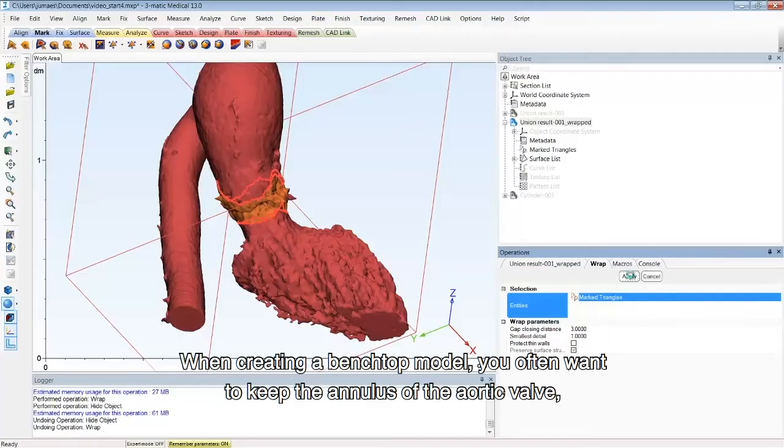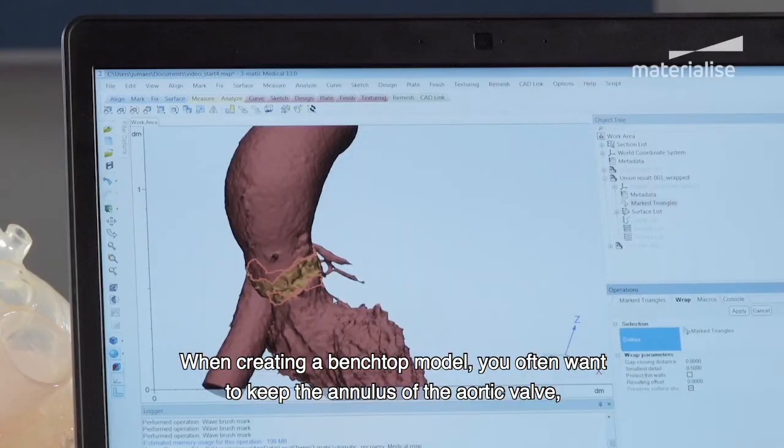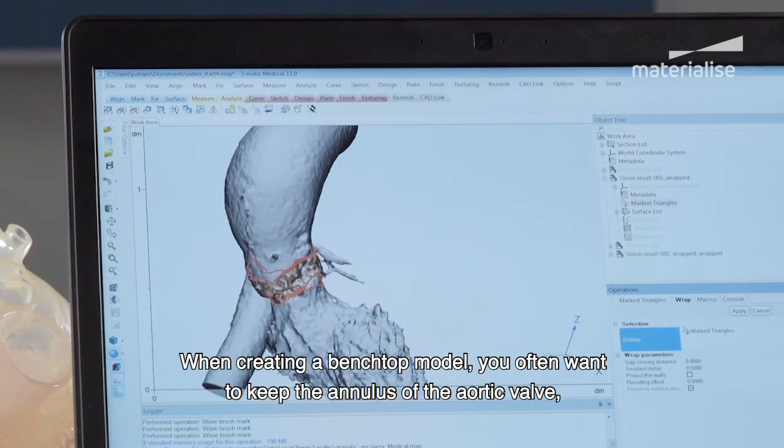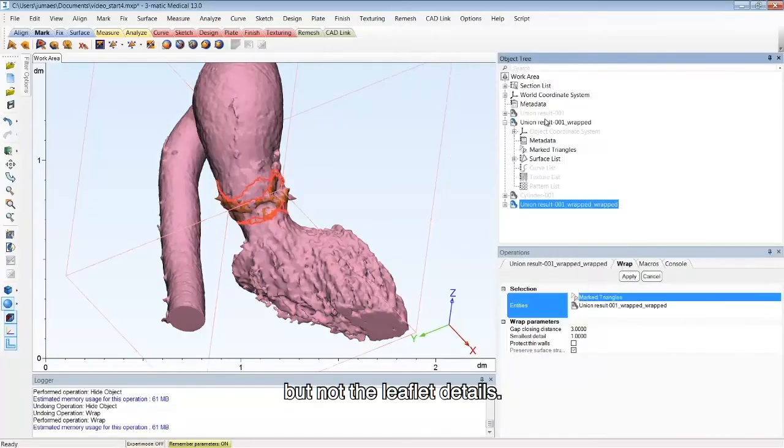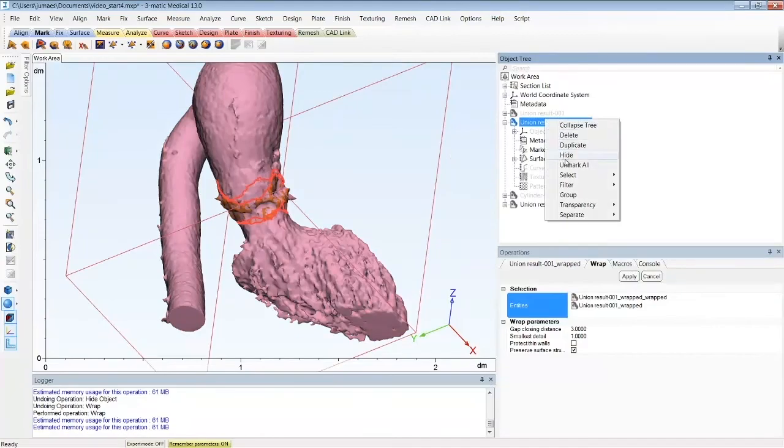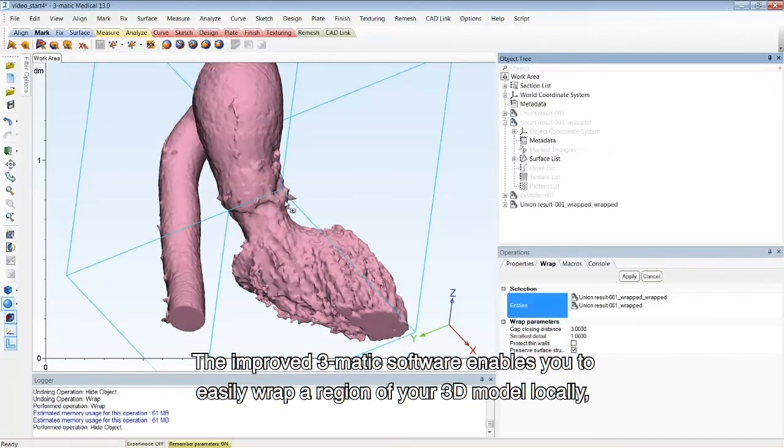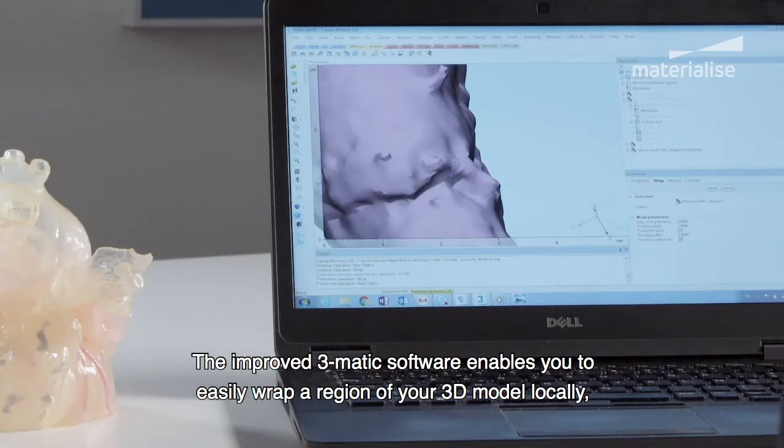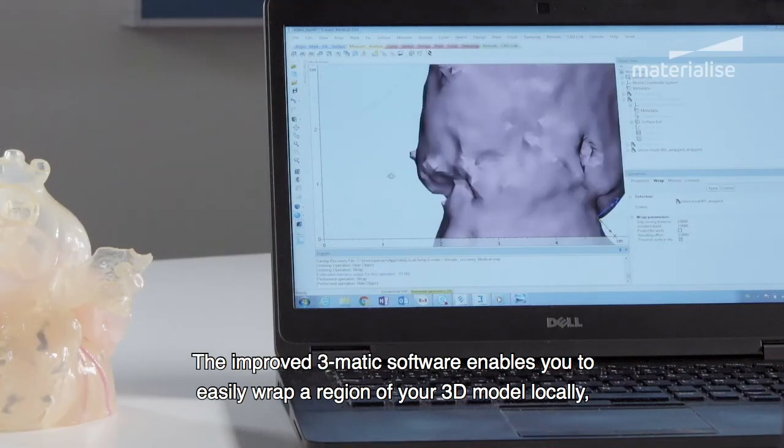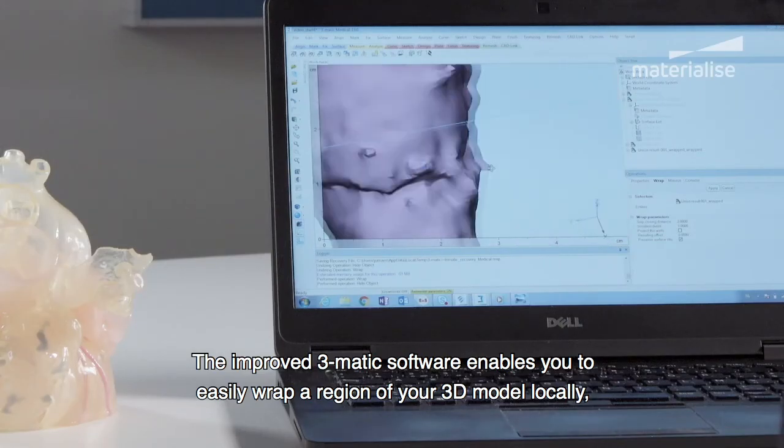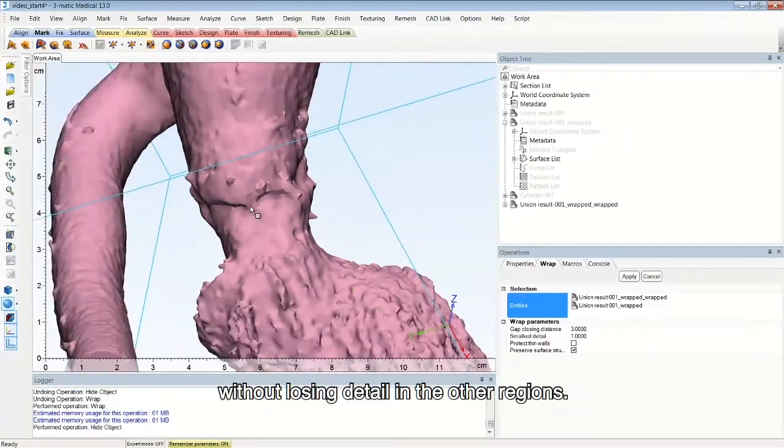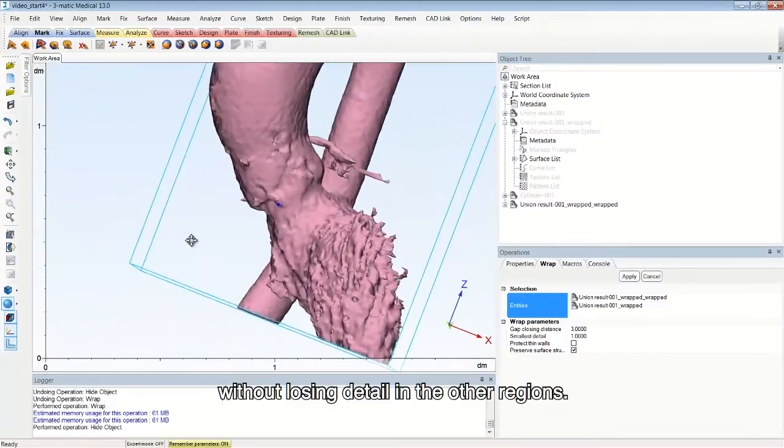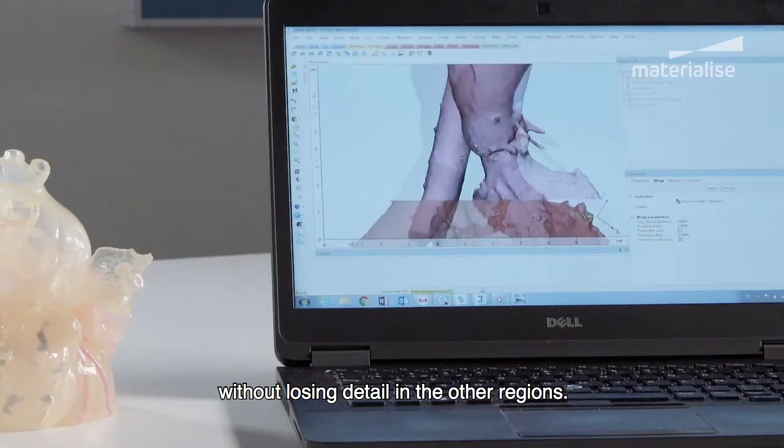When creating a benchtop model, you often want to keep the annulus of the aortic valve but not the leaflet details. The improved 3-matic software enables you to easily wrap a region of your 3D model locally, without losing detail in the other regions.